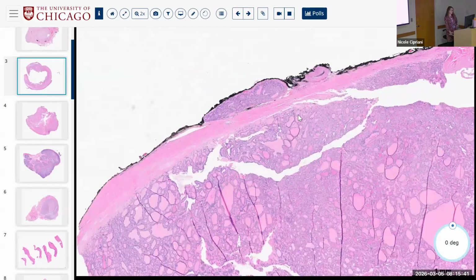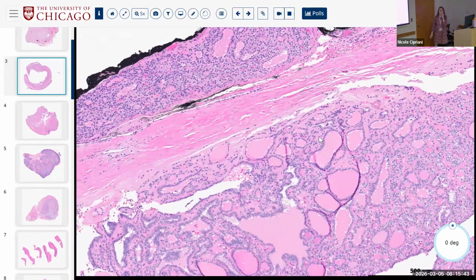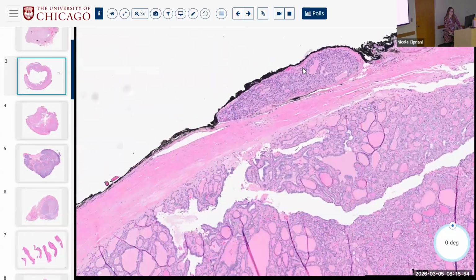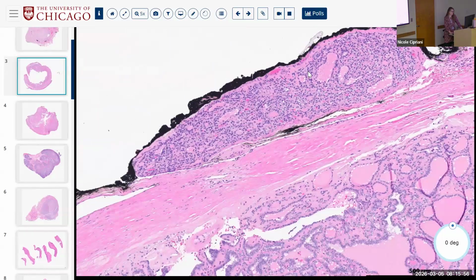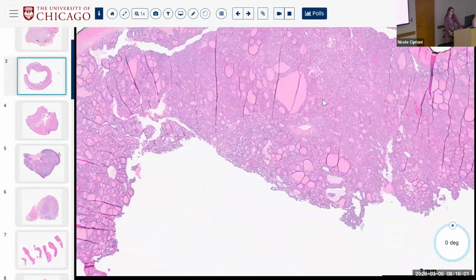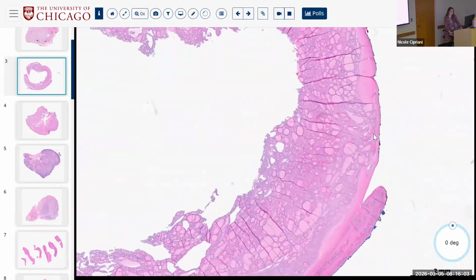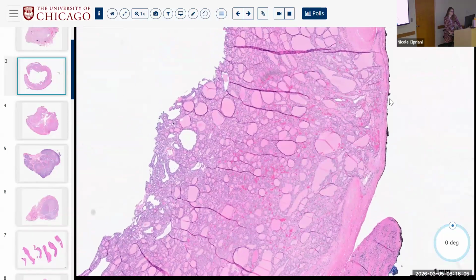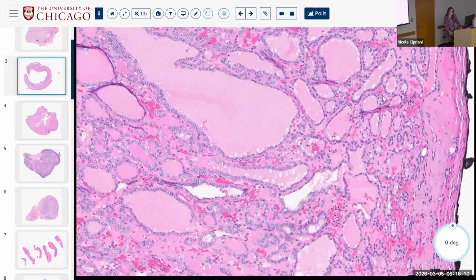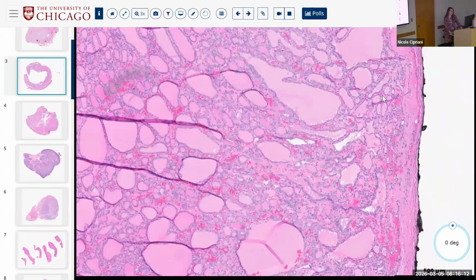So what might be your thought process in this case? Anybody? I guess I'm trying to still suss out if that thing on top is just normal thyroid that's been pinched off to the side, because this thing's really expansile. Yep. That other area where it's trying to almost mushroom out, I thought this doesn't count yet as capsular invasion. Right. It's not enough. It needs to be on the other side. Okay. Or like shout more. Yeah.